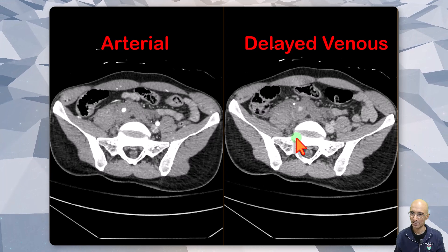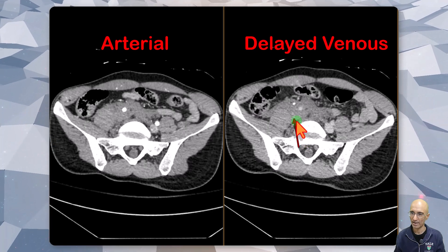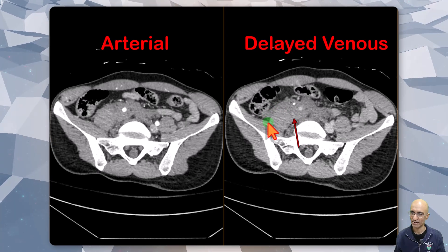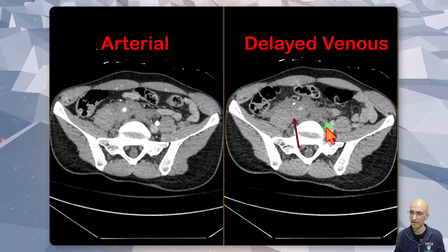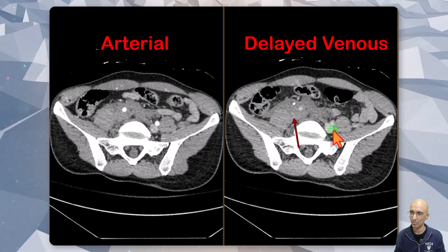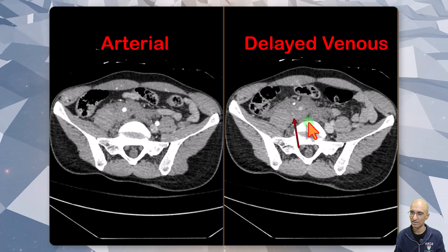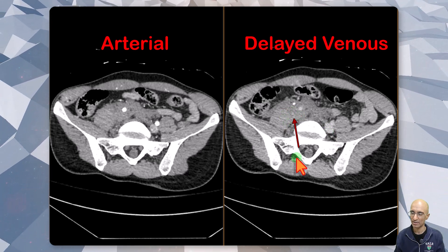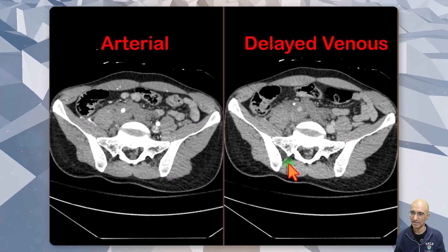As I scroll back and forth, you can see multiple foci of active contrast extravasation in the region of the retroperitoneal hematoma. We can identify the normal iliac vein on the contralateral side, but there is no iliac vein identified on the right side.